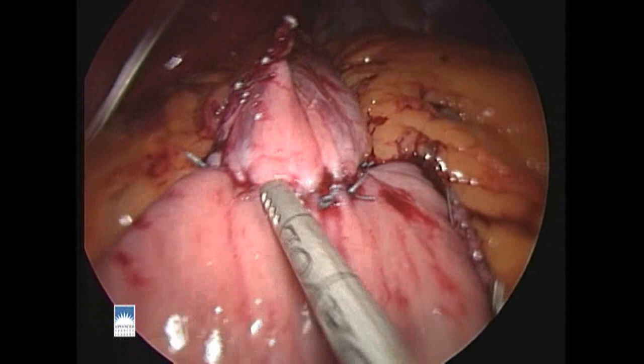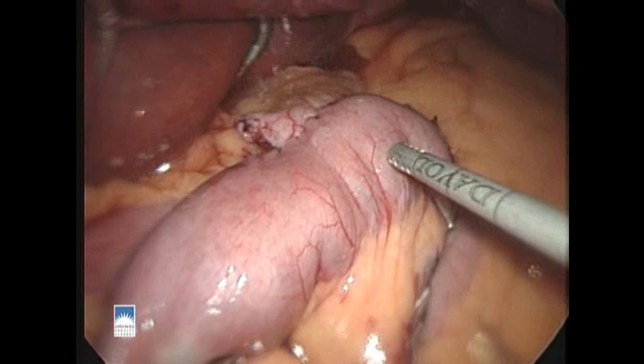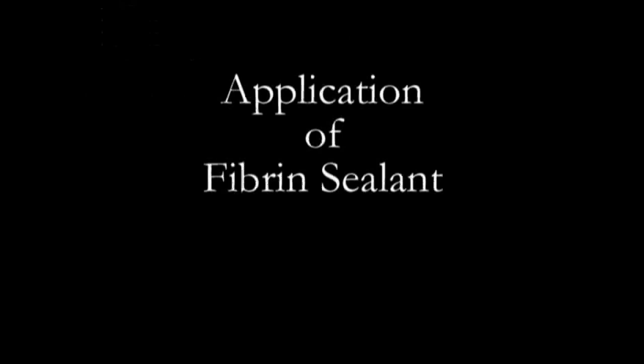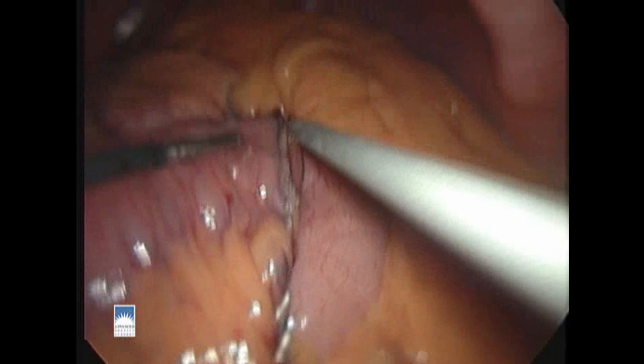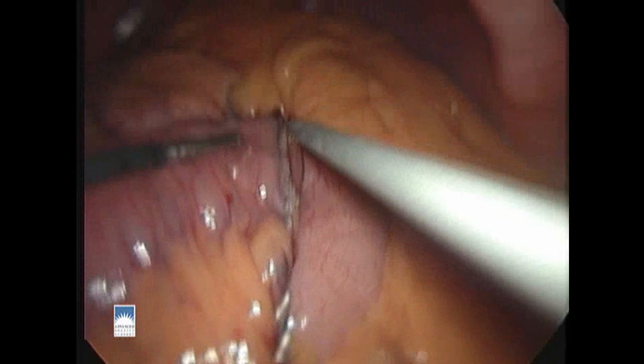Now the anastomosis is complete and we check it visually to make sure it looks good. We'll also do testing — we block off the Roux limb as it comes away from the bowel hookup and blow air into the stomach pouch through a tube slid down inside. We make sure there's no bubbling, and this means the test is passed. We apply fibrin sealant to the outside of the suture line anteriorly and posteriorly, as well as to all the other staple lines and the gap through the omentum.